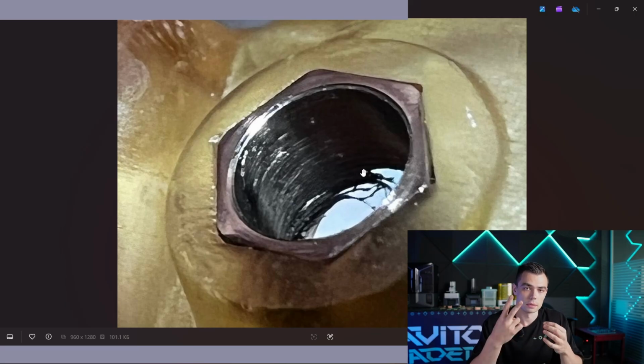And the second mistake was made by the surgical guide modelers, the surgical guide technicians, because they had not tested the surgical guide with a test drill. So I wish I had known that I have to double check everything before the surgery.